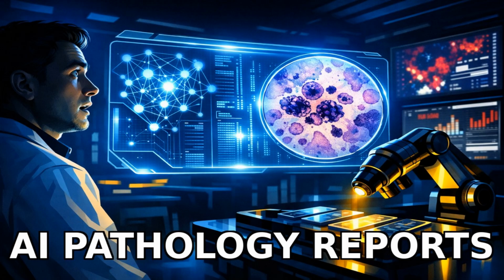Think about the implications for education and research. Students could learn from AI-annotated slides, clinicians could review faster, and labs could triage cases with a safety net. However, bias, data provenance, and the definition of diagnosis must be clarified before any clinical deployment. This study is a spark, not a switch, towards safer, smarter pathology.